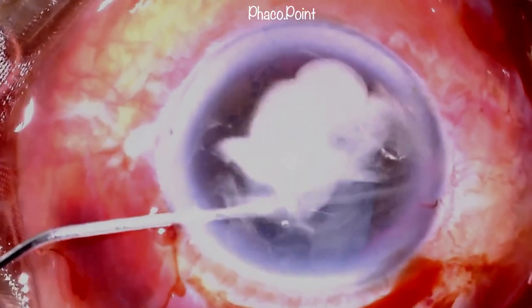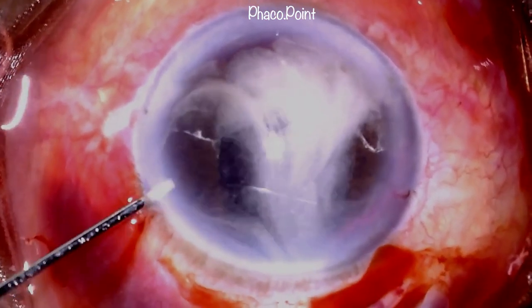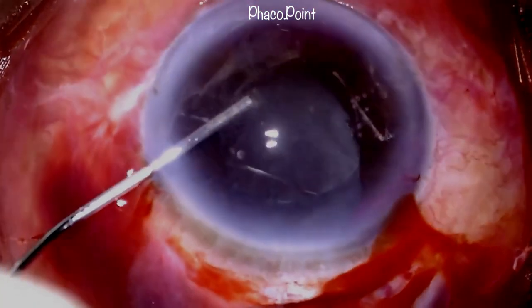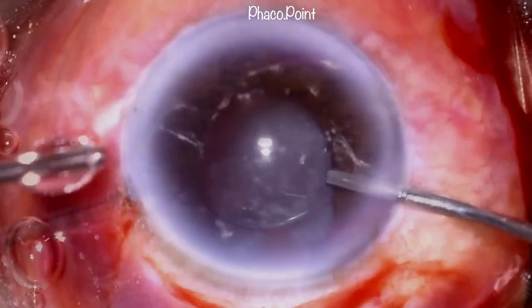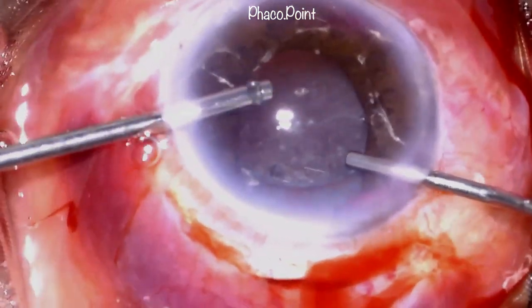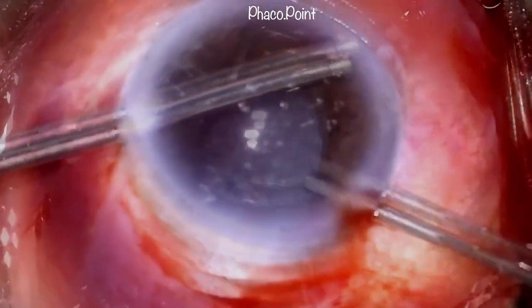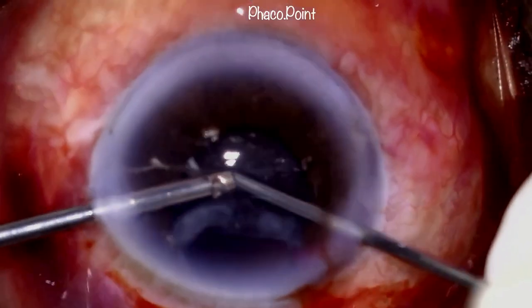Some more diluted triamcinolone acetonide is then injected in the anterior chamber and then subsequently washed out with a view of delineating any more residual vitreous that might still be there in the anterior chamber. This residual vitreous that you can see is once more removed with the help of the anterior vitrectomy. This is what you will see in this part of the video.